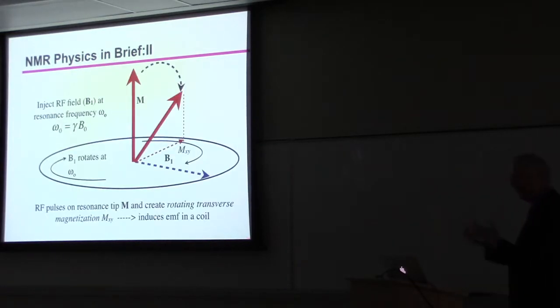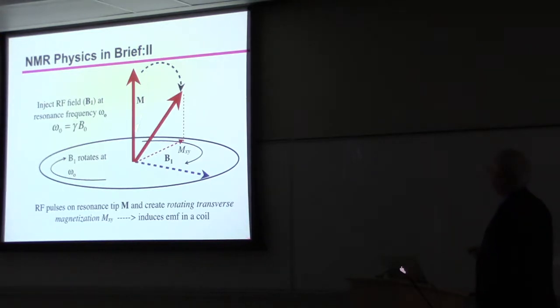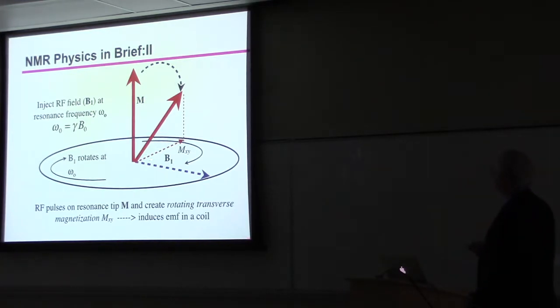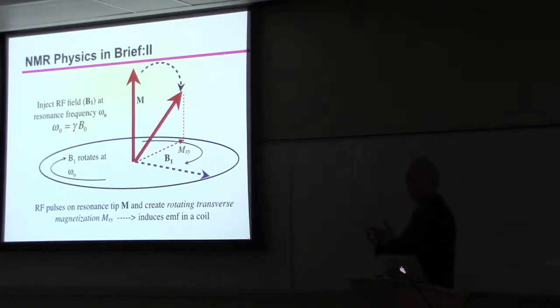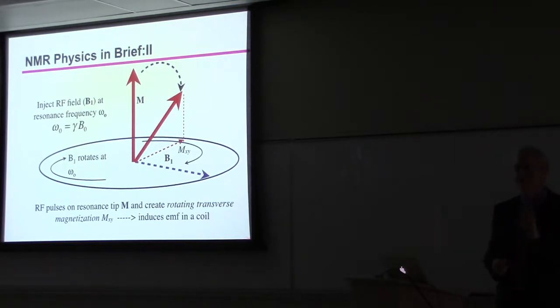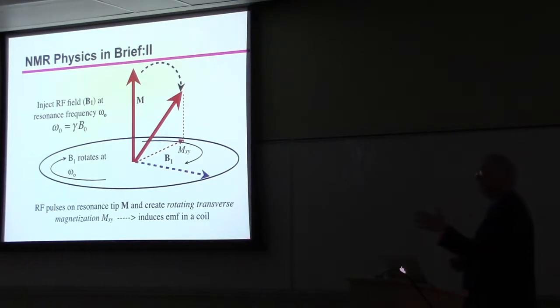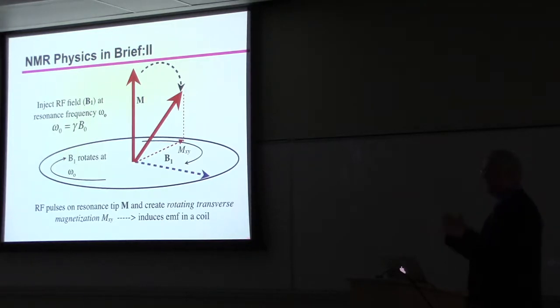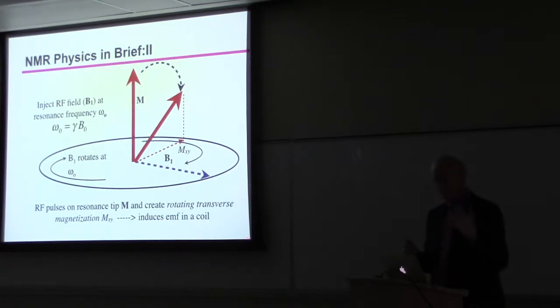The remarkable thing is, because it comes from nuclei with spin, if the magnetization is pointing here, and you inject a rotating magnetic field, the so-called B1 field or radio frequency pulse, that goes around at a particular frequency that's proportional to the field, then you can cause this magnetization to gradually tip away, and it will gradually tip down into the transverse plane. Then you can turn the field off, and that magnet is now, because of its angular momentum, its spin, will rotate around. So if you wrap a coil around the sample, you'll get a signal. So the whole idea is you stick a sample into a magnetic field, you inject a radio frequency pulse at some frequency that's selected, you turn it off, you get a signal in a coil that is just induction from a magnetization within a conductor by Faraday's law.